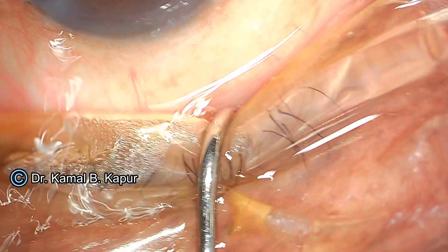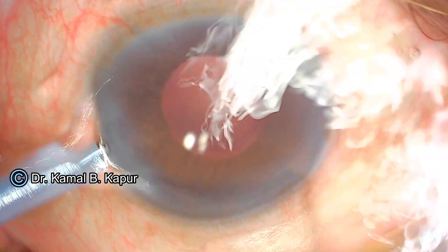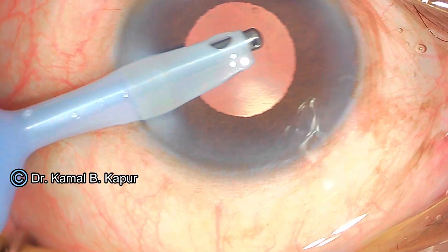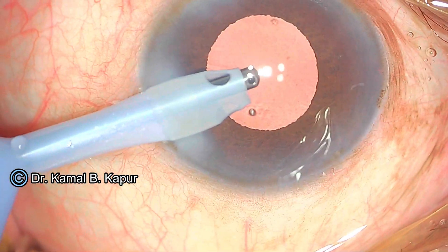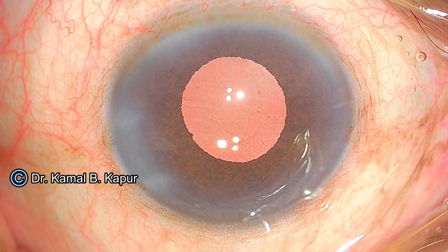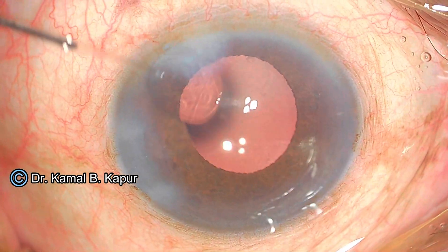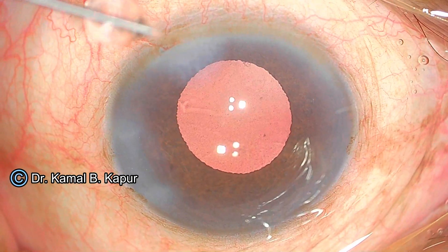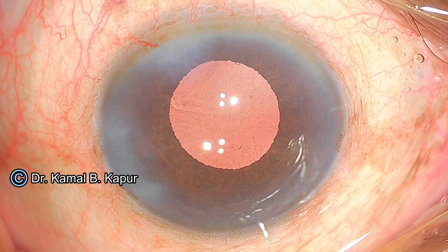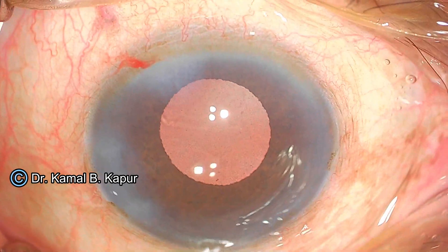Turbulence of fluid can also cause re-bleeding, so avoid that area. Just clean the anterior chamber — the whole anterior chamber is totally cleaned up. Scrape off any loose remnant trabecular meshwork tissue floating in the angle. Do not suddenly decompress the eye while withdrawing your aspiration instrument; leave the IOP slightly elevated initially. Some authors recommend leaving an air bubble inside, but once I confirm no active bleeding, I fill the anterior chamber and seal the wound.